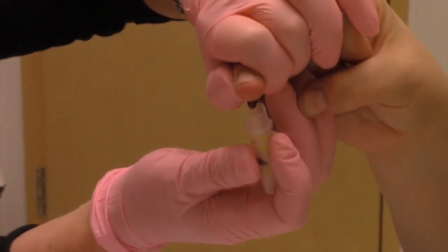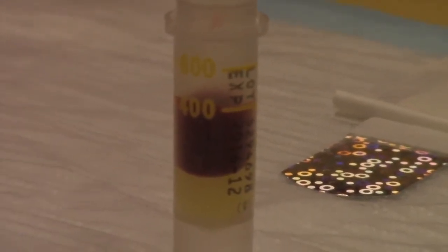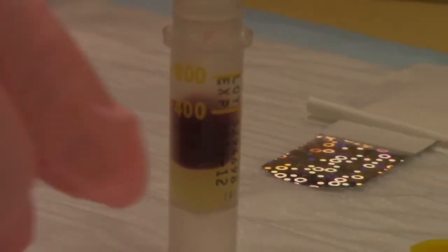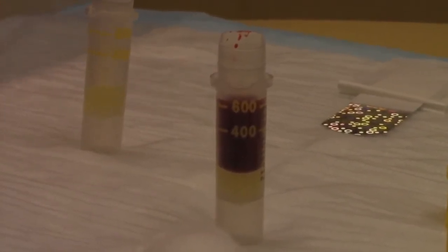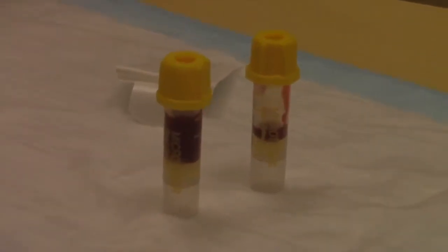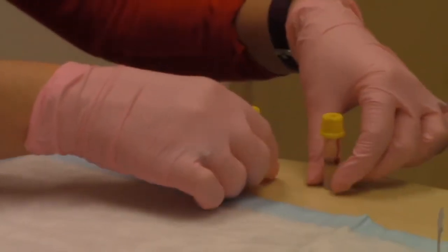We would like for the tube to be filled to the 400 microliter line at a minimum. However, filling the tube to the 600 microliter line is ideal. If there is enough blood to fill two tubes, this can be done as well. Please return the tube even if you are unable to fill it to the 400 microliter line.